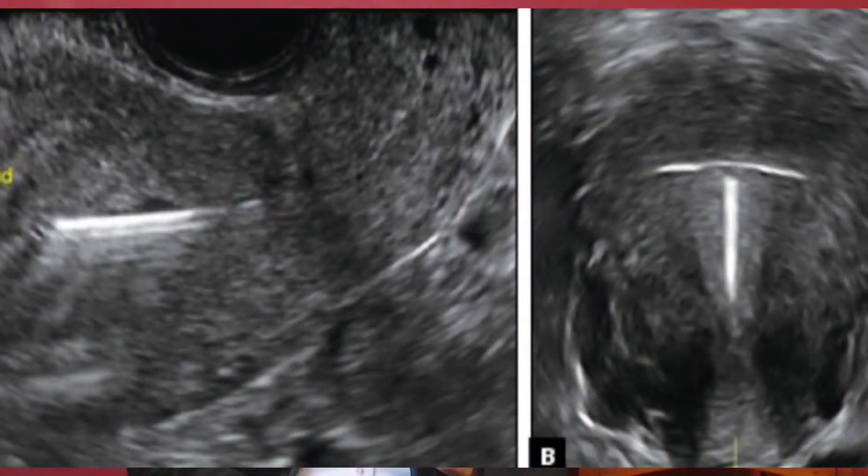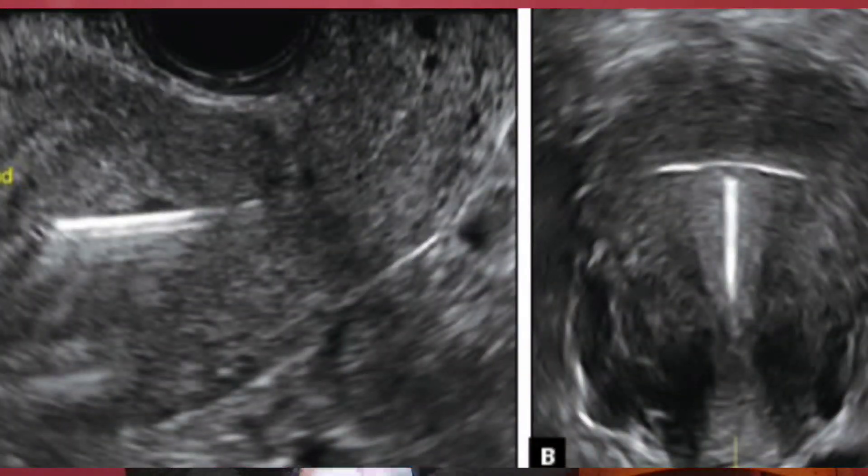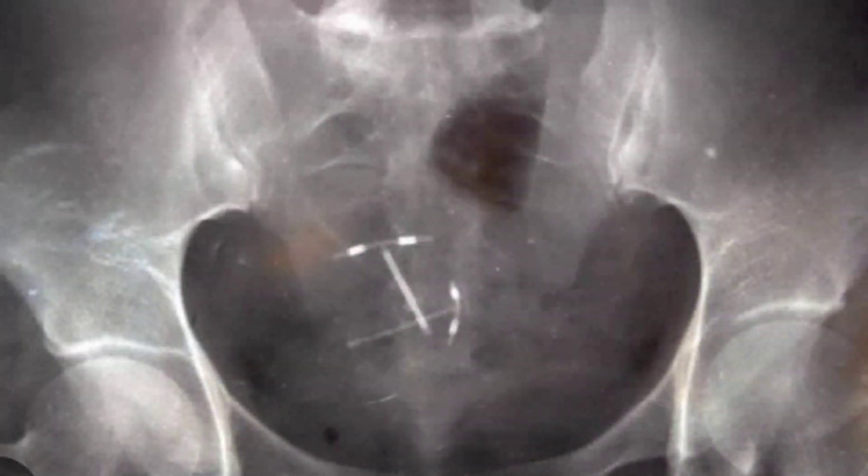The best modality to see the intrauterine contraceptive device is ultrasonography. Under ultrasound imaging, you can clearly see the intrauterine contraceptive device as an echogenic and reflective material. If, because of body habitus or bowel gases, you cannot see the IUCD, then you should opt for X-ray, where you will still be able to see the reflective and radiopaque intrauterine contraceptive device within the pelvic region.